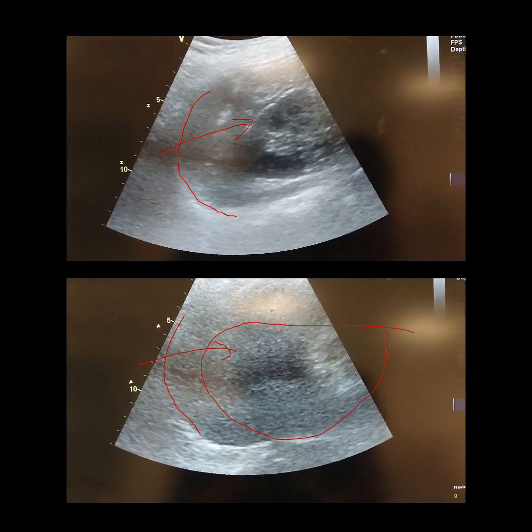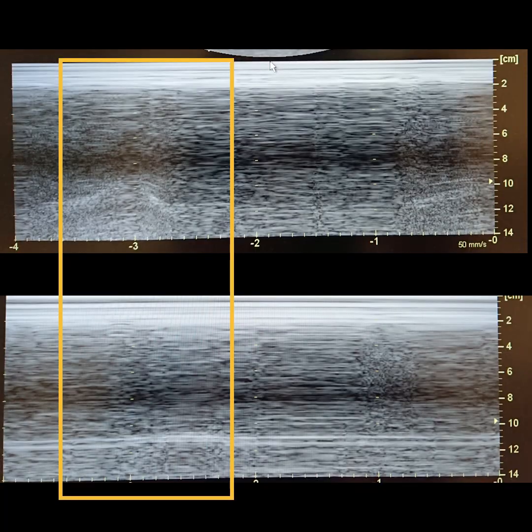What we did next was apply M-mode. We placed the M-mode line on the diaphragm. On the left — the normal side — you can see the bump during inspiration, which is called diaphragmatic excursion. However, on the right side, which we suspect is abnormal, there's a flat line. Even though the patient is breathing so much, there's no diaphragmatic excursion at all — and that's why she has difficulty breathing.